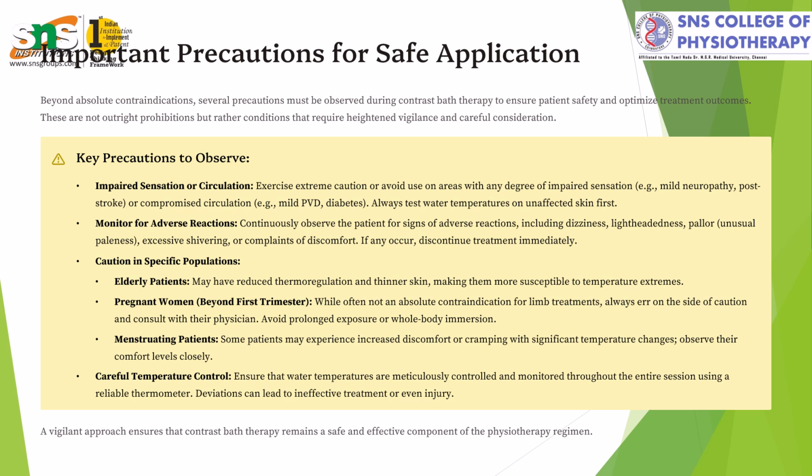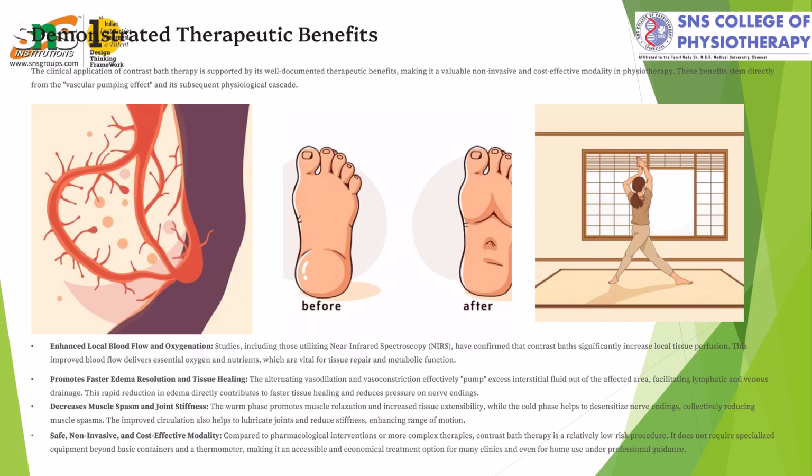In elderly patients, we should give very mild heat because their skin is very thin, and extreme cold or extreme hot may affect the elderly patient's skin. For pregnant women beyond the first trimester, we should take some precautionary measures with the contrast bath. For menstruating patients also, we have to take precautionary measures. Then careful temperature control should be there.